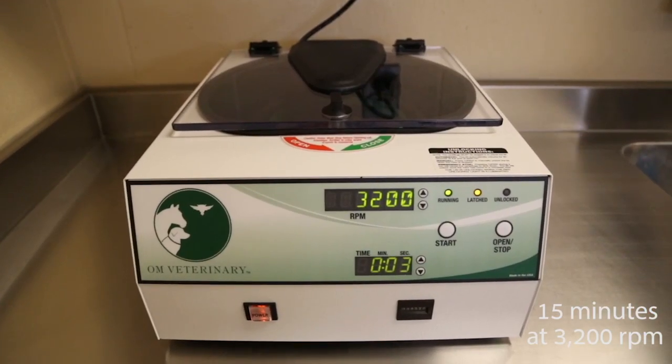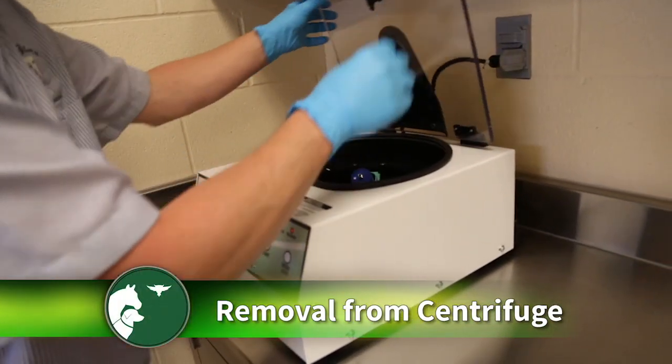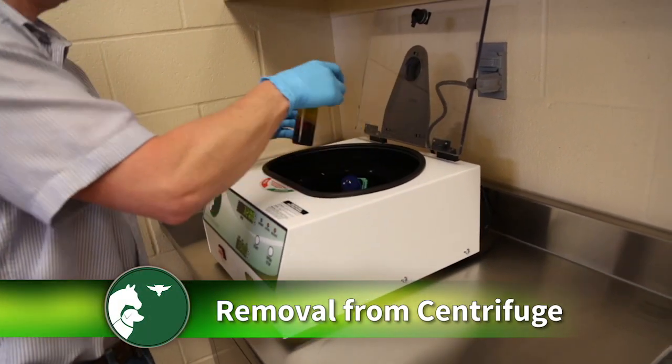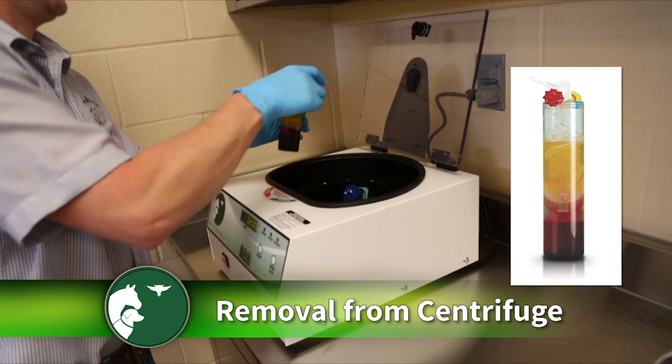At completion of the 15 minute spin, press the open button. Open the top latch and remove the device. You will notice the separation of the red blood cells at the bottom, the 6 ml of buffy coat platelet-rich cell suspension in the middle, and the yellowish platelet poor plasma on the top.